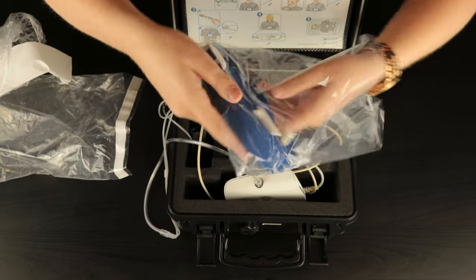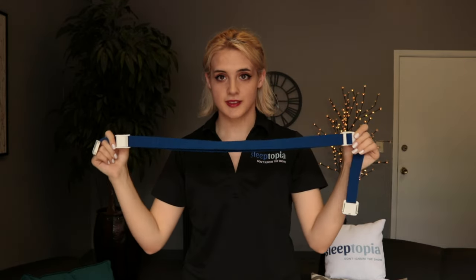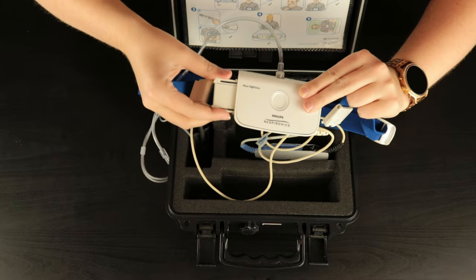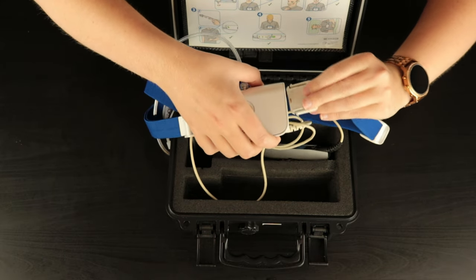Now you're going to want to adjust the belt so it fits properly around your sternum. There is an adjuster right on the belt — just flip this piece open and adjust to your preference. Next, take one end of the chest belt and click it onto one end of the Alice device just like a seat belt. After that, wrap the rest of the chest belt around yourself so it can click onto the other end of the device.